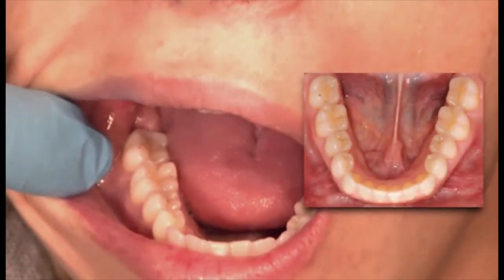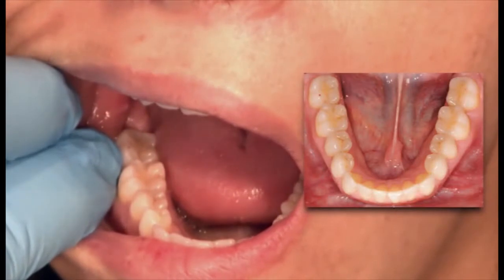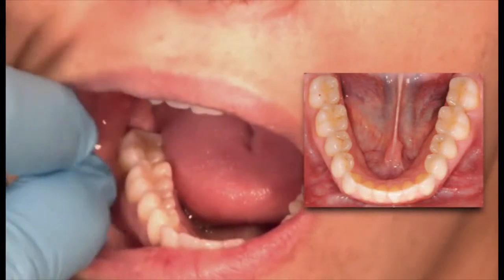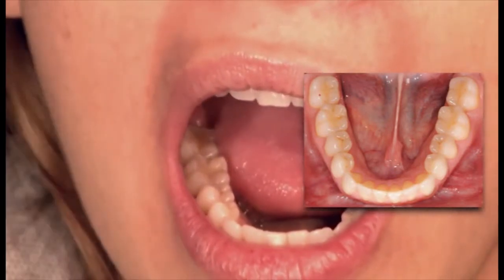Now, as we begin the equilibration, I don't want to touch any cusp tips. I only want to deepen the fossa. So we'll take the KS0 fine.